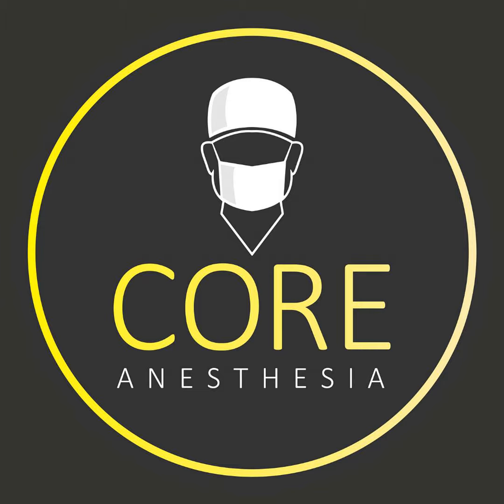Another thing I've seen is when you're using your bear hugger, sometimes that can actually cause problems with the BIS reading. You should also keep in mind that there is a delay in your BIS monitor. So what you're seeing up on the monitor is not a real-time evaluation of their sedation status. It lags behind as much as about 30 seconds. And so often by the time you see that BIS number go up, you're already way behind the curve as far as treating your patient.